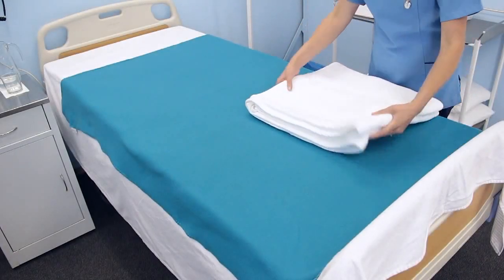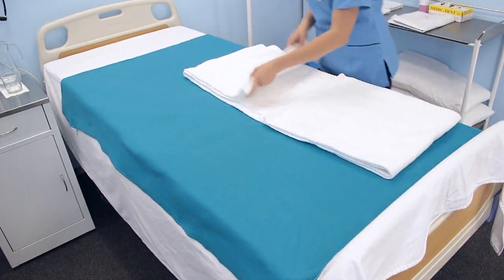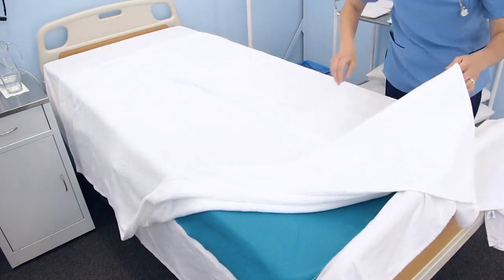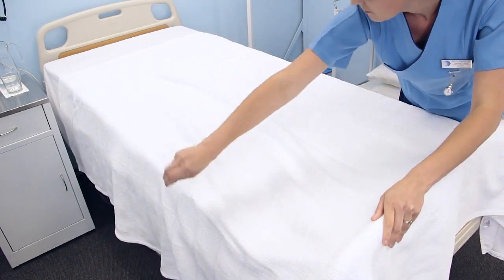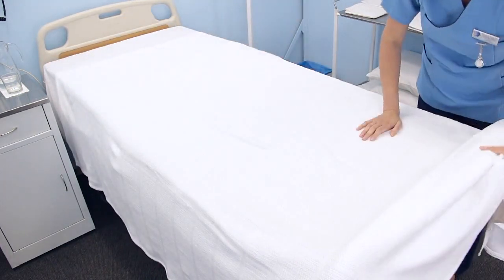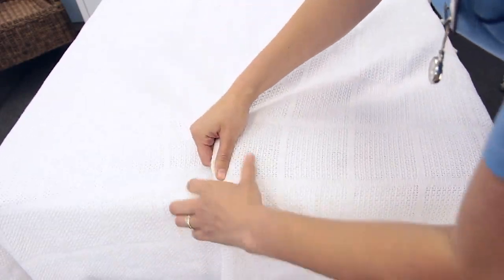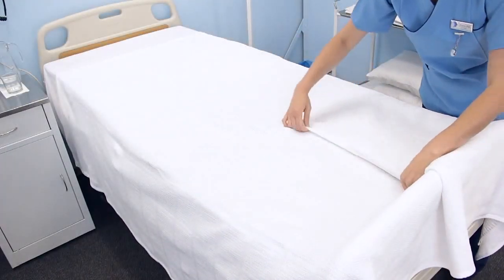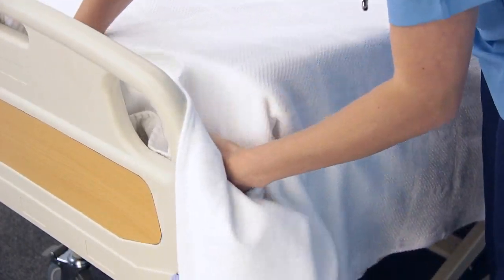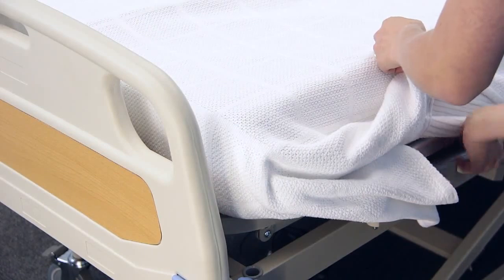Place the bedspread with its center fold in the center of the bed, in the same position as the blanket. Unfold the bedspread and straighten it over the bed. Create a pleat in the top linen at the foot end of the bed before tucking it under the mattress. This will supply sufficient space for the patient's feet. Tuck the top sheet, blanket and bedspread under the foot end of the bed, on the near side, and fold the corner.